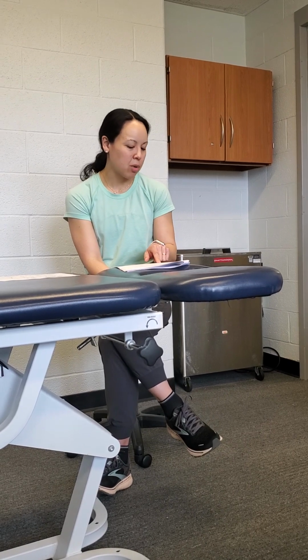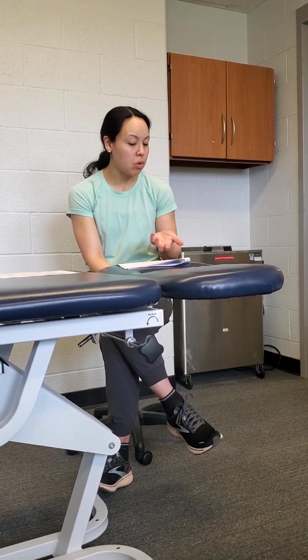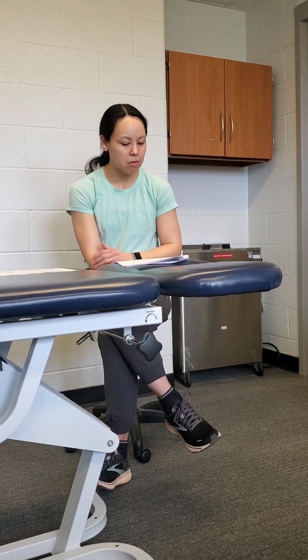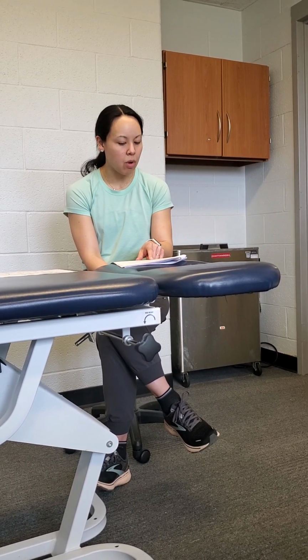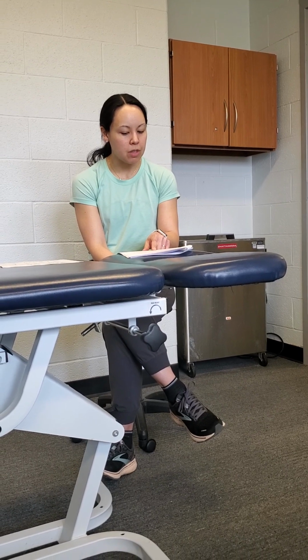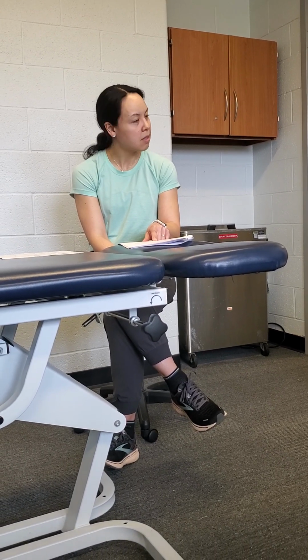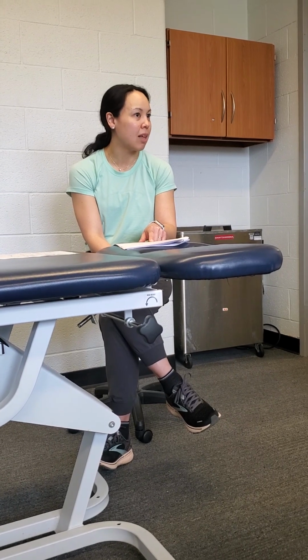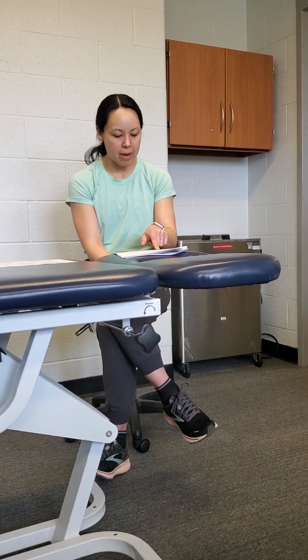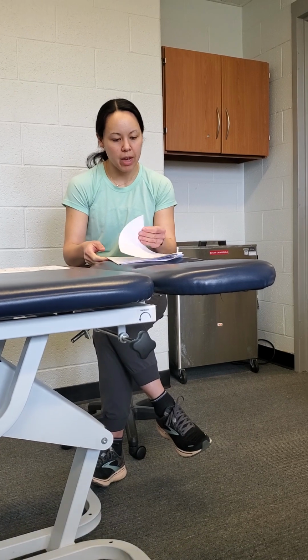And then I just kind of broke down an example of a patient maybe doing some quad sets with the passive BFR, but you can see it's still the same protocol of like 30, 15, 15, 15 would be how many quad sets they'd be doing, or if even the quad set was too painful, they were just literally lying there and doing nothing. But that would be the breakdown of that.